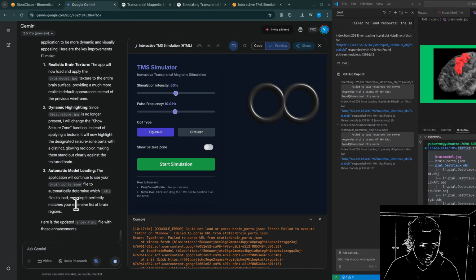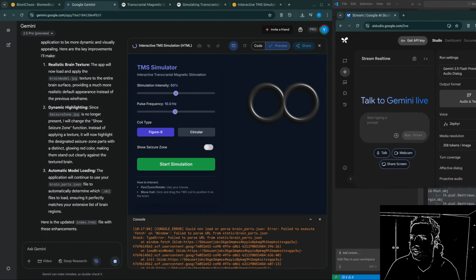That's helpful. Another tool mentioned is SPM, statistical parametric mapping. It's well known for other brain imaging analyses, and its segmentation algorithms can sometimes be used as a preliminary step before maybe using other software for the meshing itself. Okay, interesting. So there are dedicated tools to streamline this complex modeling stage. Fantastic. So stage one is complete.